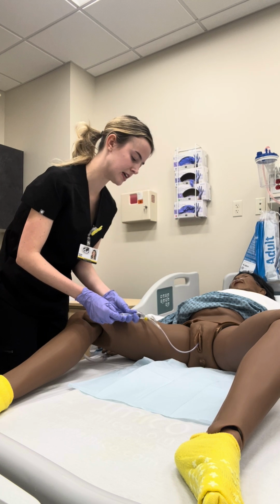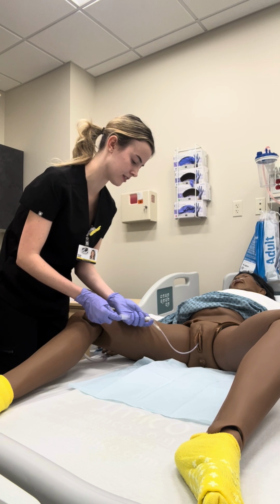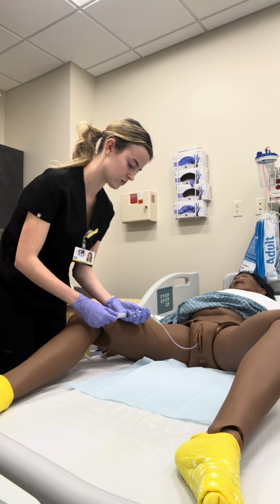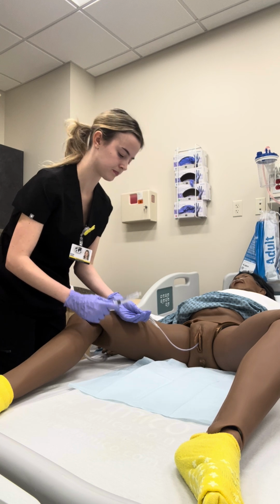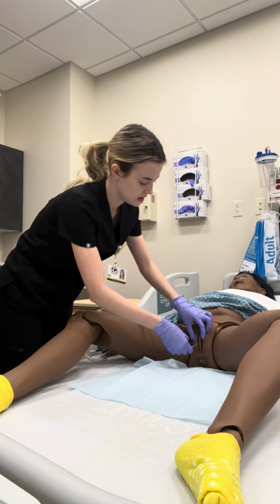And I'm taking out 10 milliliters, the same amount that I inserted into the balloon when I first put in the catheter. Okay. So took out the 10 milliliters and now it's ready to be removed.